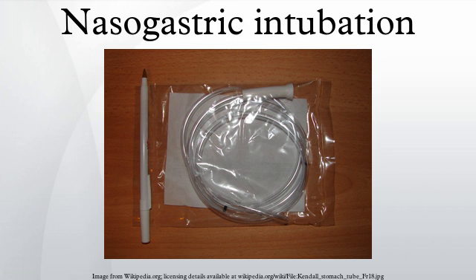Self-insertion of nasogastric tube for home enteral nutrition. Enteral tube feeding can be a source of discomfort and reluctance from patients. Self-insertion of nasogastric tube for home enteral nutrition may be efficacious and well tolerated in patients receiving enteral nutrition for chronic conditions.